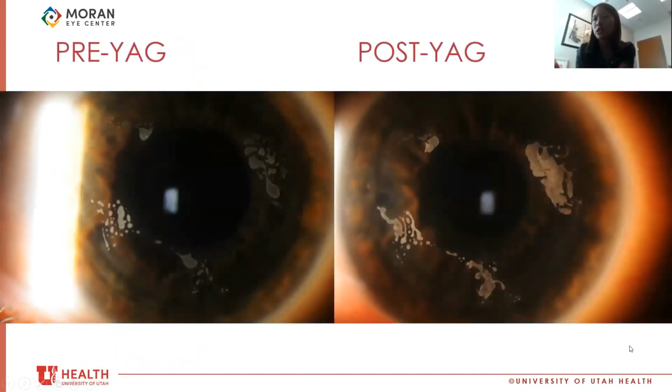And I achieved nothing but making it worse. So I tried to make it better. I actually made it worse. So you can kind of see pre-YAG, post-YAG. This is a few weeks after the fact. All these little individual islands of epithelium had coalesced into larger areas. So really, I mean, you think all these spots here, especially this spot right here, is a lot worse than before. So the YAG treatment did not work for her.